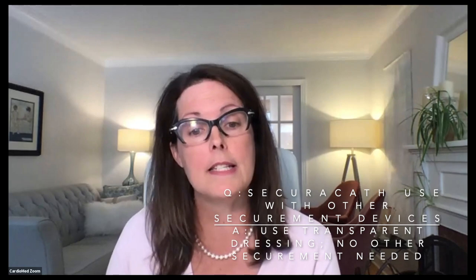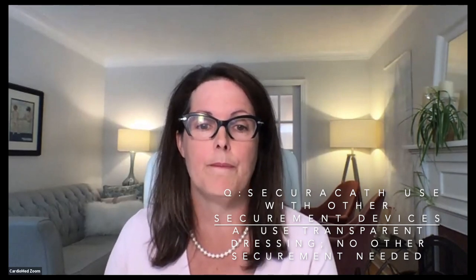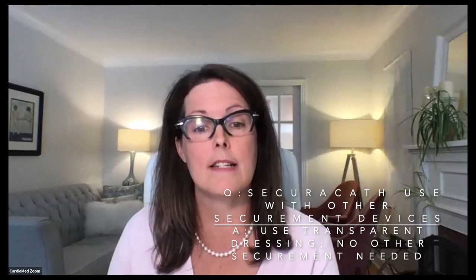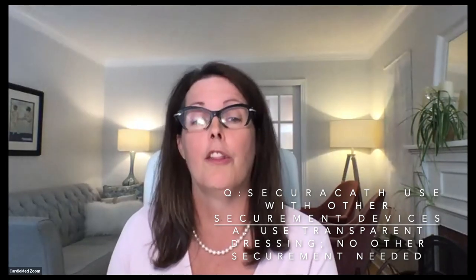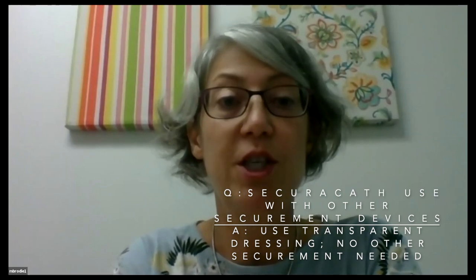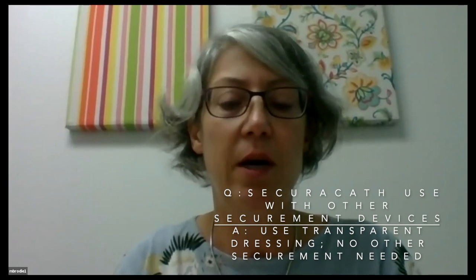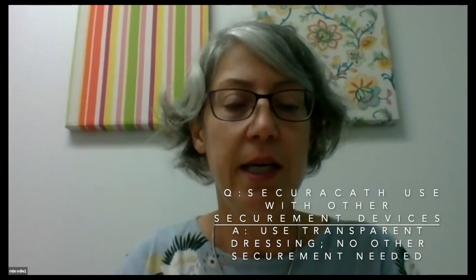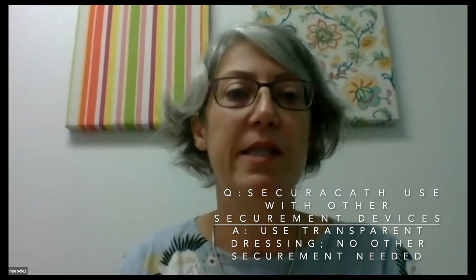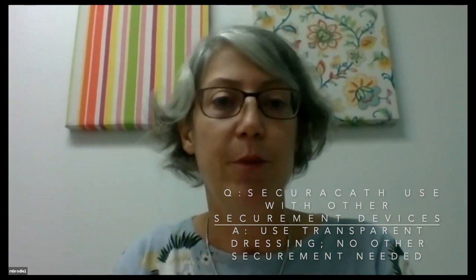So if the SecurAcath is in place, and I know in both of those two LHINs they do have just the traditional transparent film dressings that are not securement dressings, they would use those dressings on top of the SecurAcath. And we use the IV Tegaderm IV Advanced for our standard dressing, which is a securement dressing. We still use it so that we're not switching between products. The only reason we would not use that is if there was a sensitivity to that dressing. But I know that the PICCs do come with an adhesive-based securement device. You just don't need it because you can switch to some other type of securement dressing or discard that out of your dressing pack. Either way, you wouldn't need both.